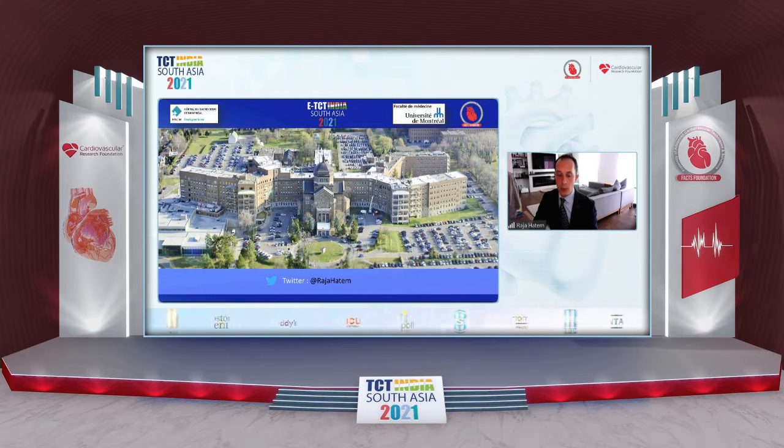That's an excellent point. And actually, I went through this myself, because when I came back to my lab, we didn't have any coils. They used to call the interventional radiologist to come deliver their coils. So when I ordered the Axiom neurocoils, for example, we had a session with my colleagues where, in vitro, outside of patients, we practiced deploying these detachable coils through a microcatheter, either a FineCross or a Turnpike. So it's very, very important you practice outside of the patients in order to become very comfortable and for it to become sort of second nature in case it happens in a case.